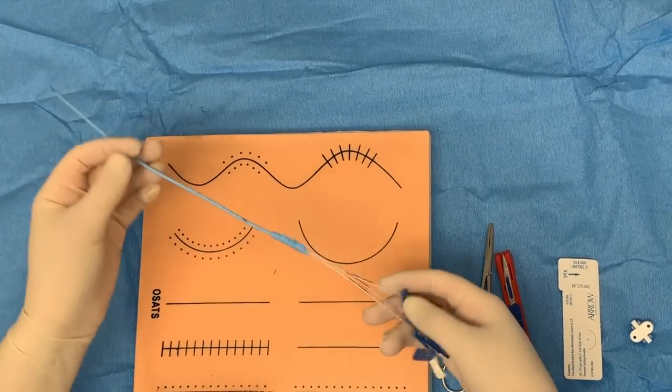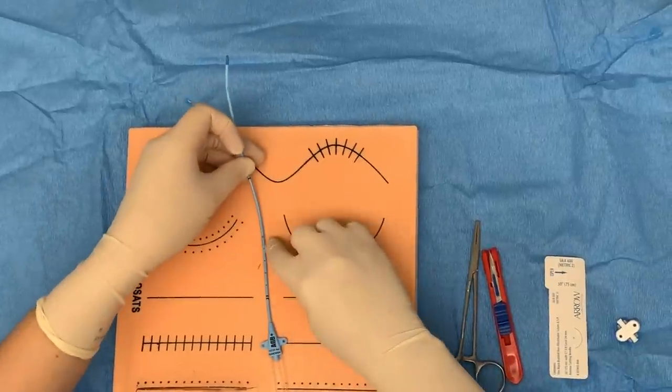Here is our triple lumen catheter and it's going to go to the 15th mark.